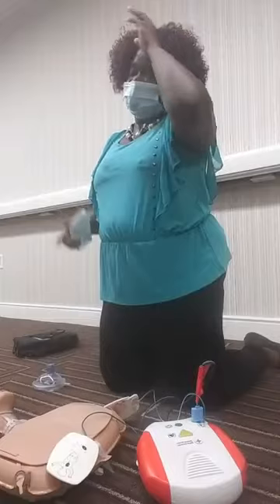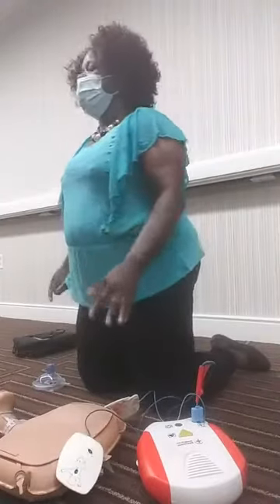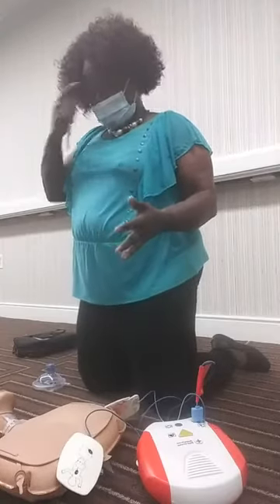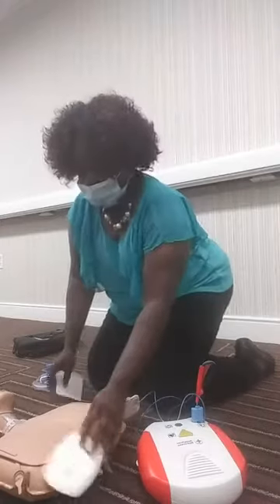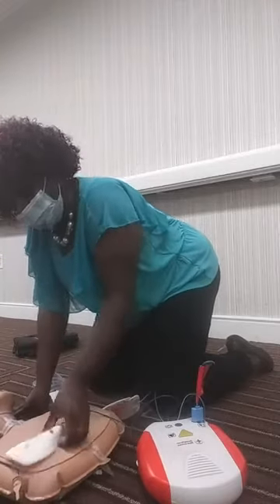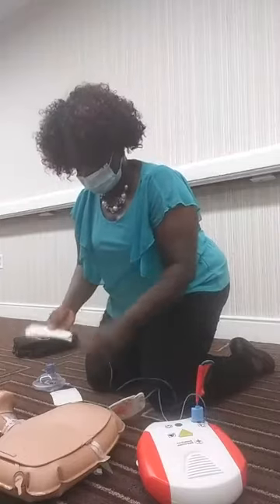For people with chest hair, you can place the pads, but sometimes the pads may stick and sometimes they may not. The AED will prompt you to press the pads firmly. If after doing that a few times it still doesn't work, just snatch the pad off — it will remove the hair — and then replace the pads.